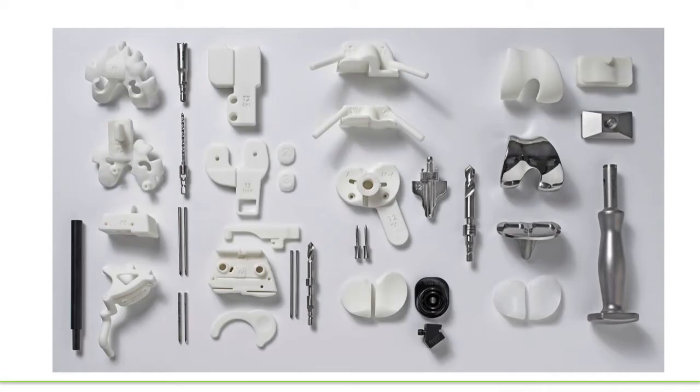So tomorrow, if I see somebody who needs a knee replacement, we send them for a CT scan, which may be done next week, pending insurance approval. And then if it's the beginning of August, by the middle of September, we have all the parts made, and they come in a shoebox. And this is what the table looks like when everything is laid out, and we've got various parts.